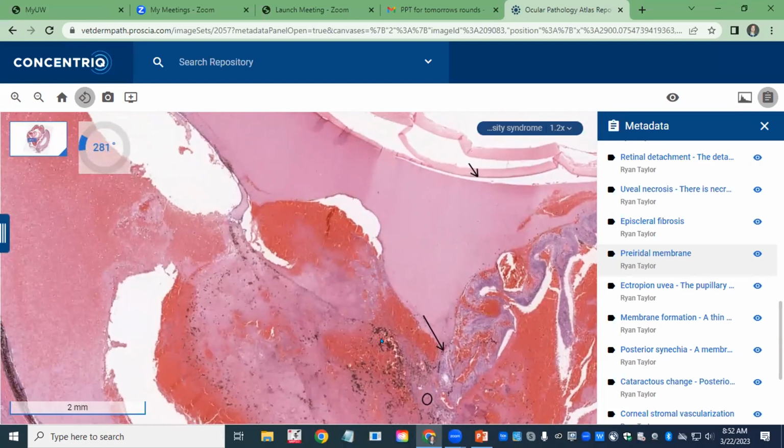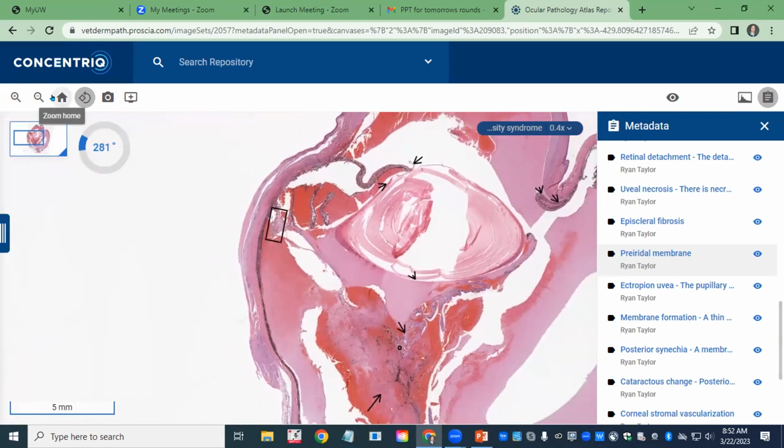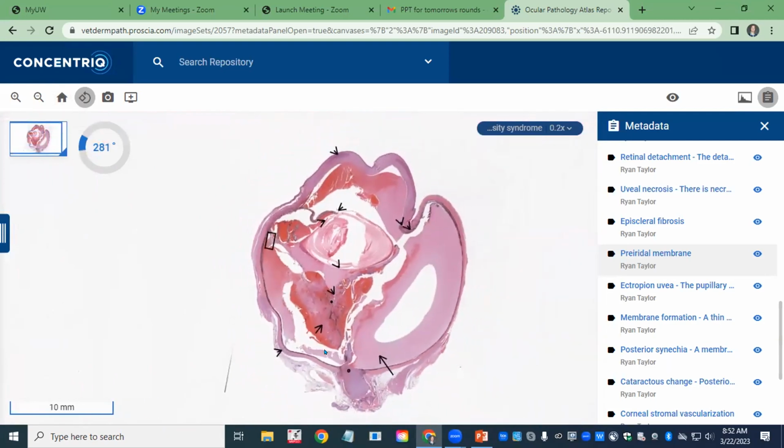As an aside, for folks who are super familiar with Coplowisms, you can actually have development of a fibrinoproliferative lesion associated with hyperviscosity syndrome and retinal necrosis. So don't be confused. If you see an accumulation of fibrin with blood vessels or vascular channels in it, in an area adjacent to or associated with an area of retinal necrosis, that is a fibrinoproliferative lesion. We often associate that with systemic hypertension. But in cases of hyperviscosity syndrome, it's more associated with the poor perfusion, retinal necrosis, and then the reaction of vascular growth associated with that.